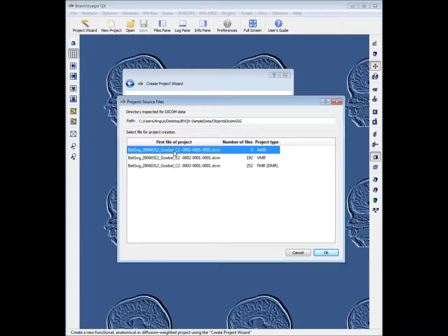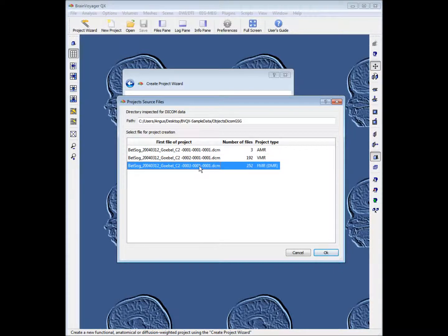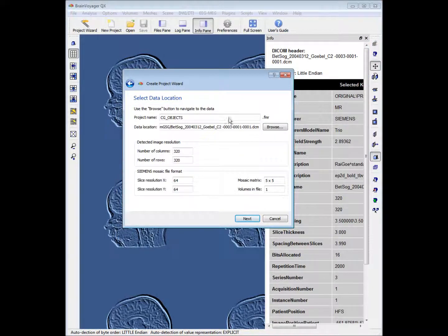The first option is a localizer or scout. The second option is the T1 anatomical, and the third option is our FMR — this is the experimental run we want to choose. So we'll click that.